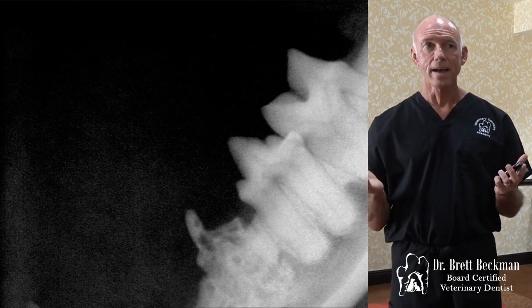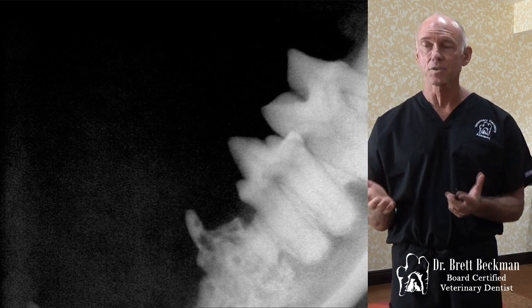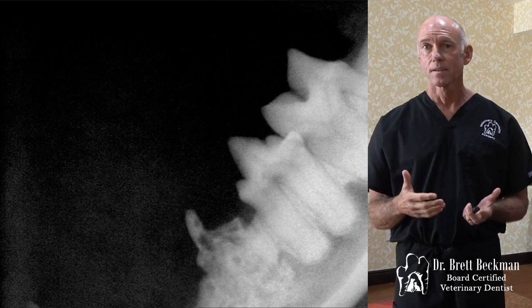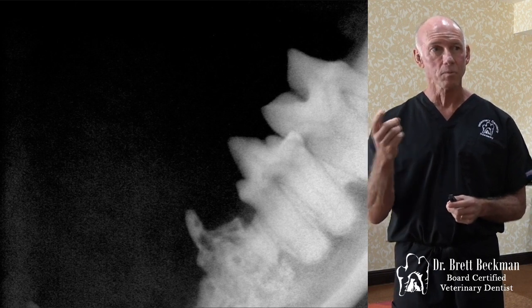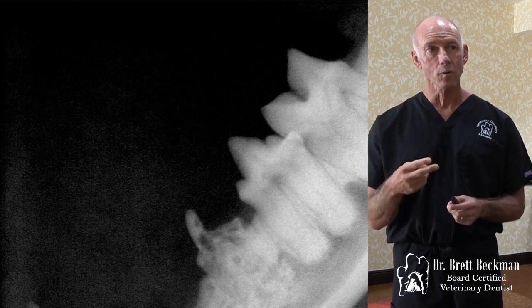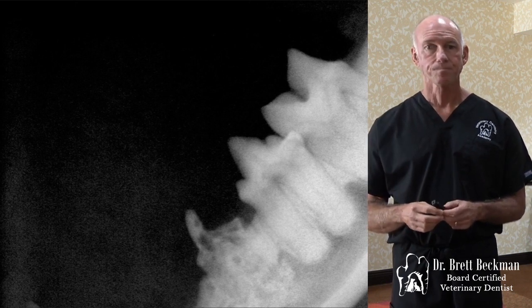It doesn't matter what age the cat is. We can see this starting at a couple years of age, though usually it's not until 6 or 8. But if we start to see that, remember, if there's one, there's a 50% chance there's another one. So it's a good indication for full mouth radiographs.